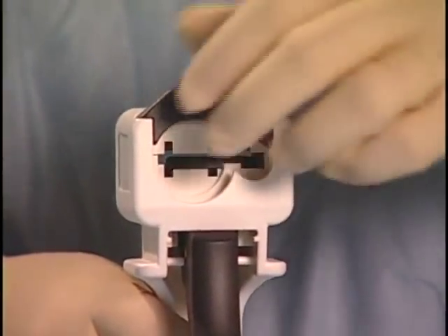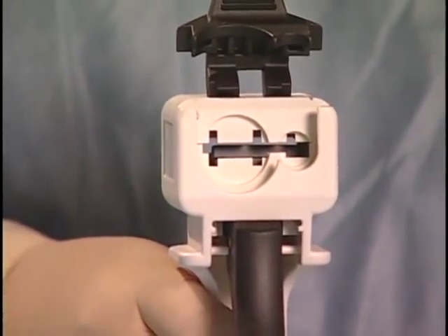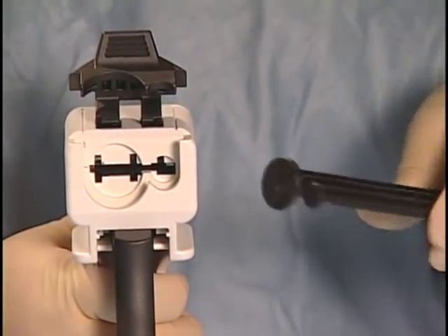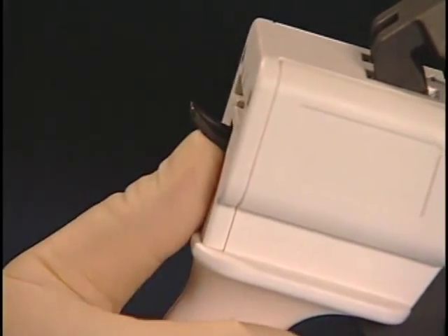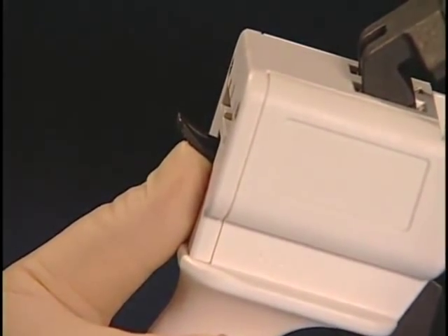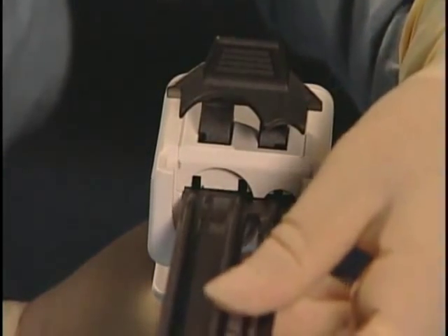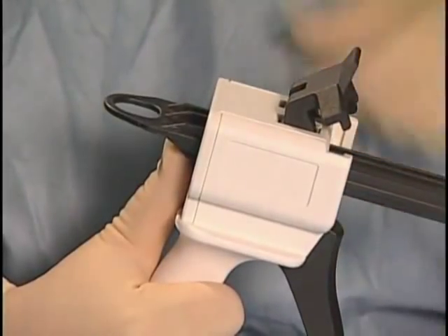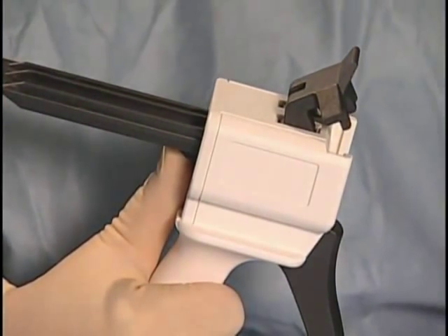To begin assembly, lift the large latch on top of the delivery device handle. Ensure that the plunger is aligned correctly and that the ribbed surface is facing downward. While pushing upward on the small latch located on the back of the handle, insert the plunger with the ribbed surface facing downward into the slit located on the front of the device. Still holding the plunger latch upward, push the plunger back completely.